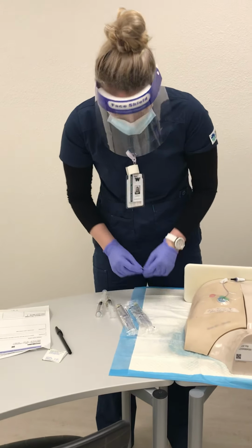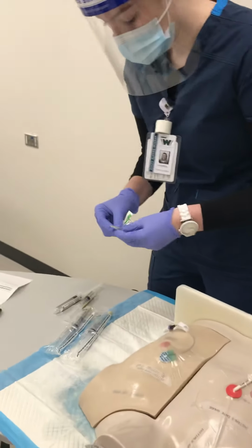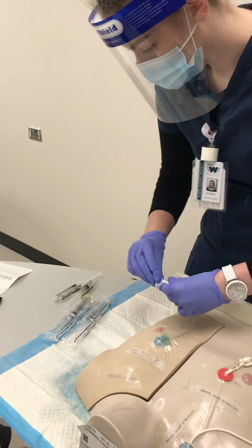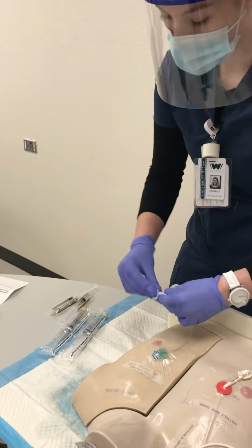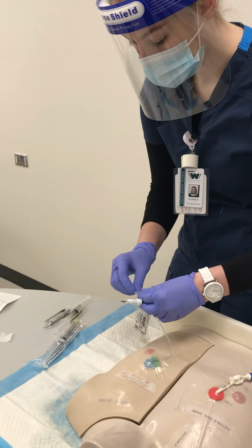So, first we are going to clean the port, 10 to 15 seconds in a circular motion. And then we're going to let it dry. And first we need to flush.